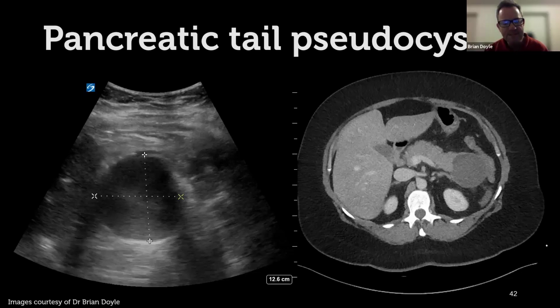I haven't seen any before either, Brian, so we're together on this one. All I know is it shouldn't be there. And it got me thinking that I never actually heard a POCUS talk on the pancreas. It's like this organ that we never, ever even think about. And honestly, Suean, I think you're doing a fantastic job. I feel really educated now. I'm not sure I would have traced that back to the pancreas.